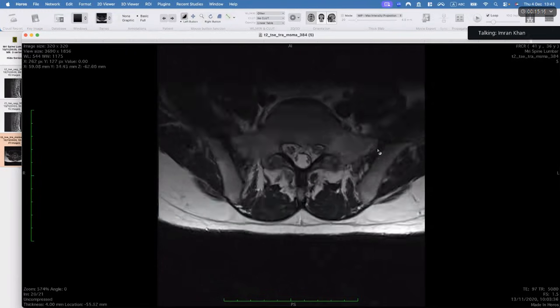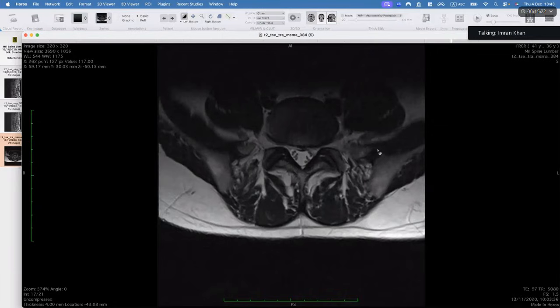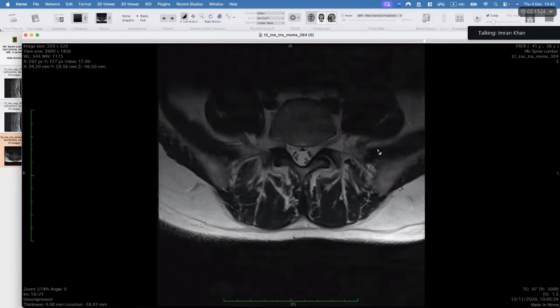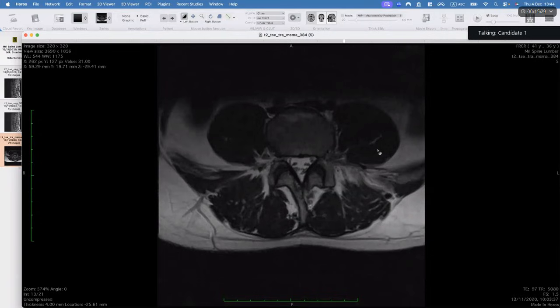Okay, this is a patient who has been referred by their family physician with query low back pain, occasional radicular symptoms, but no specific neurological findings. There is no previous history otherwise present for you to evaluate.